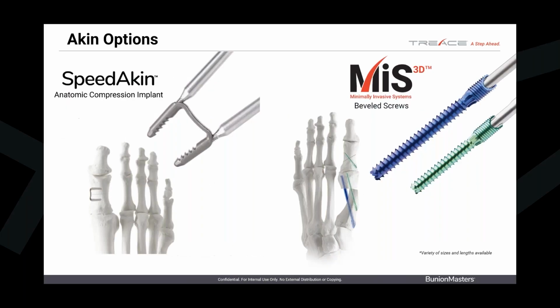So 99% of the time we do an Akin when we do a minimally invasive bunion. And the only time we don't do an Akin is when we wish we did do an Akin. But the small 1% is because they're a really young population. They have a flexible deformity. The first ray goes into perfect rectus position, and we don't have any snapback or valgus deformity. But you will get in the habit of always doing an Akin. Now, there's 2 ways to do that. You can do that with a speed Akin compression implant, or you can do it percutaneous.